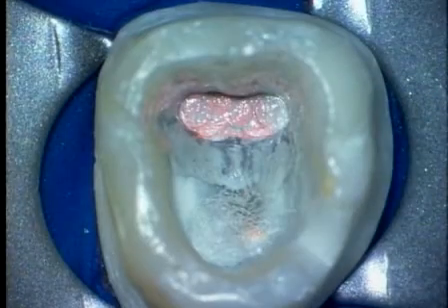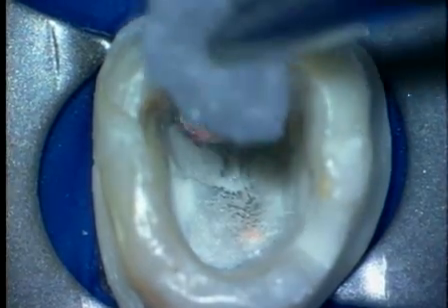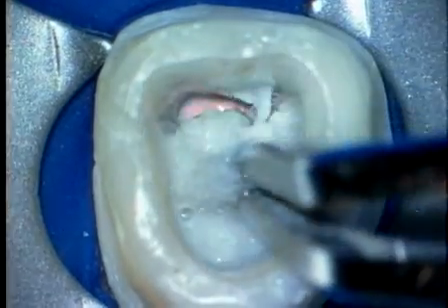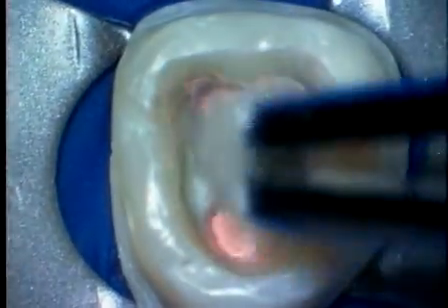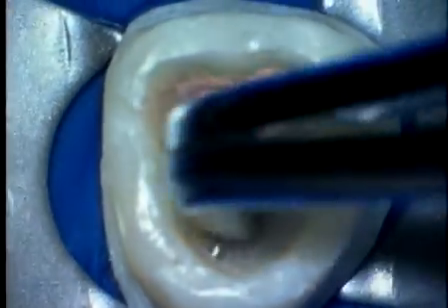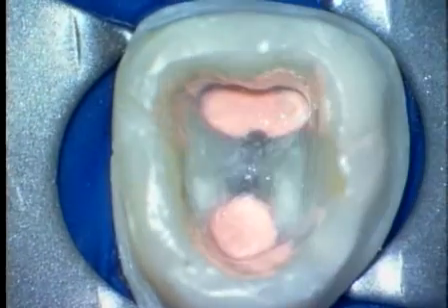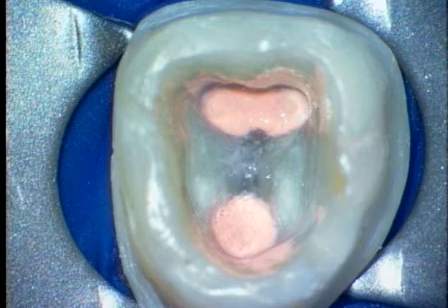At the completion of endodontic treatment, we should focus on the rest of the seal. In this case, at the conclusion of obturation, a chemical such as chloroform is used on a cotton pellet to remove residual sealer from the pulp chamber. When this has been accomplished, rinse the pulp chamber with 70% isopropyl alcohol to remove any remaining residues. Removing all sealer from the pulp chamber discourages crown darkening and promotes successful bonding procedures.